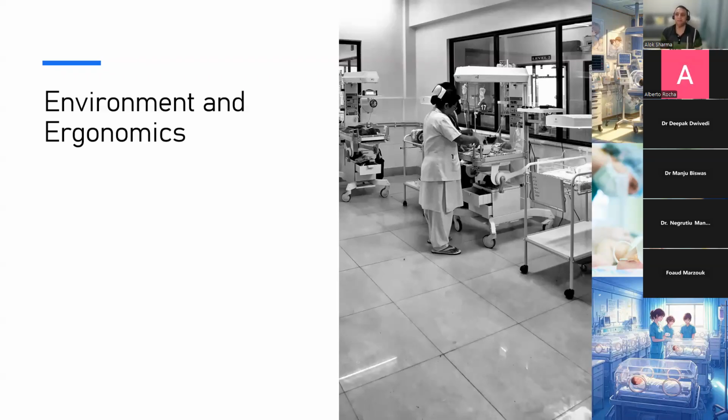So have a look at me. Can all of you see me? Yes. Okay. So instead of doing the scan like this with my right hand, having had the machine, what I might have to do is actually do the scan with my left hand in the front and have the machine outside of that space onto my extreme right.